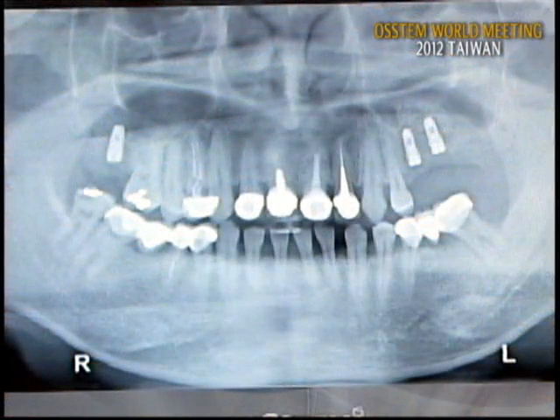Hello, doctors. I'm back to show the result of my live surgery. Okay, in this panorama radiograph, we can see that on the right side I tried the sinus lifting with the CAS-KIT, and I think it's not obvious, but there's some dome-shaped bone grafting in the apex of the implant. And on the left side, I tried the lateral window approach with the LAS-KIT, and I think the amount of graft material was 0.8 cc, so it's a little bit much grafting.